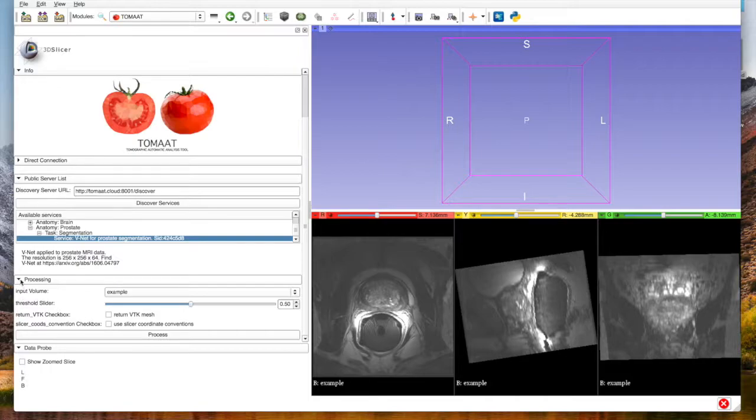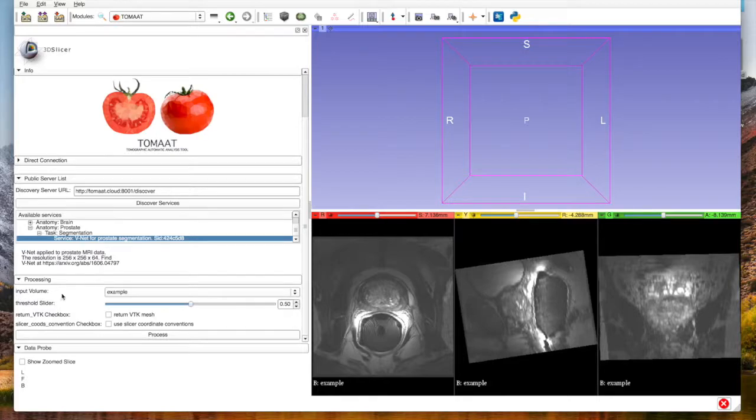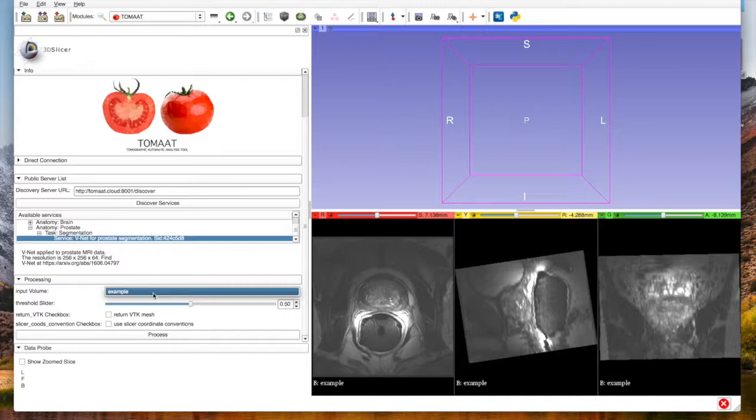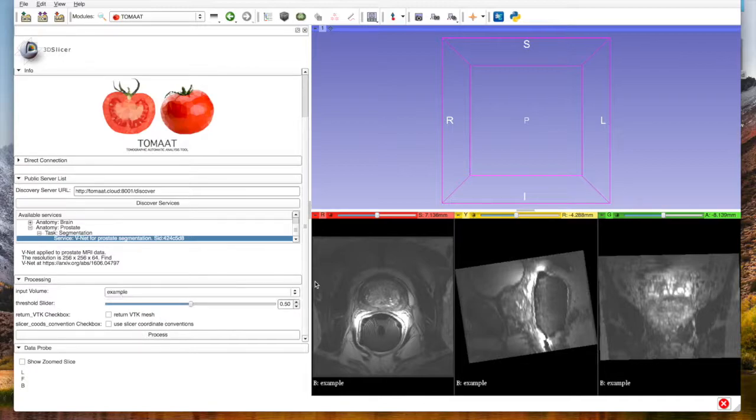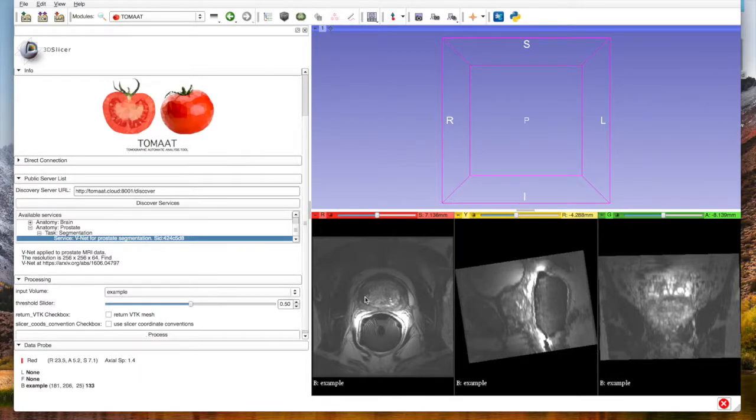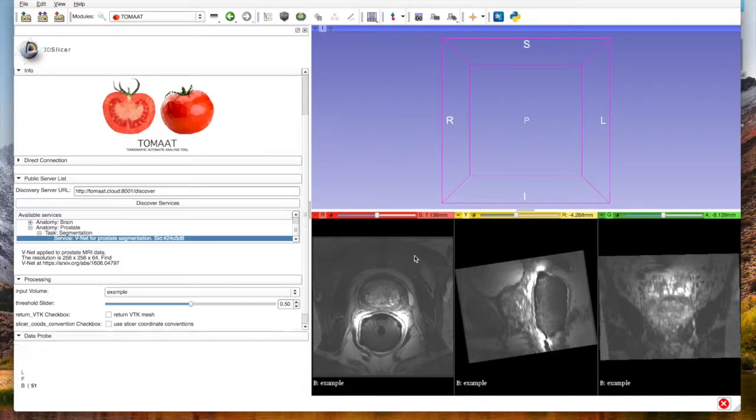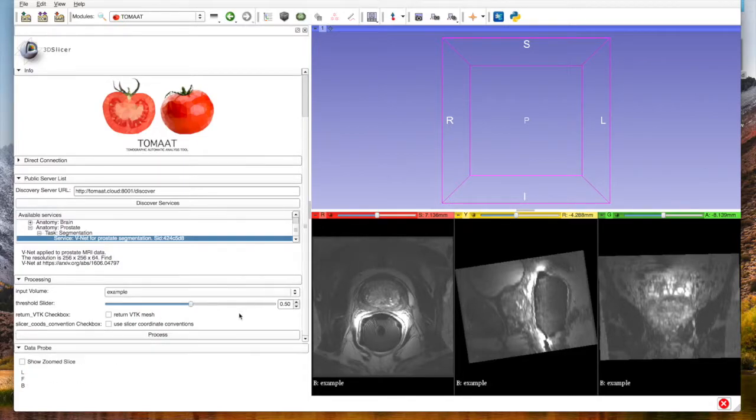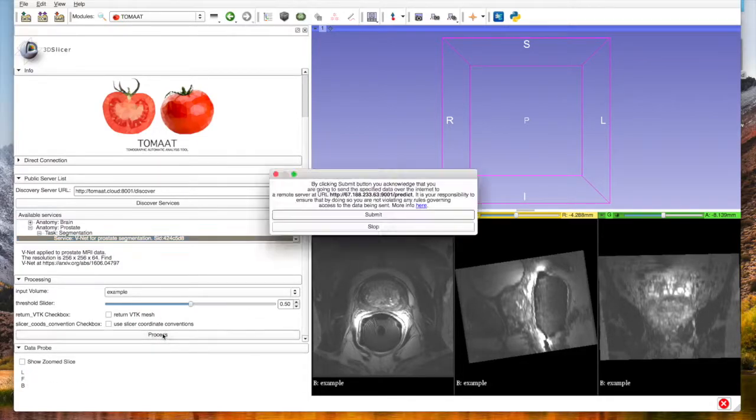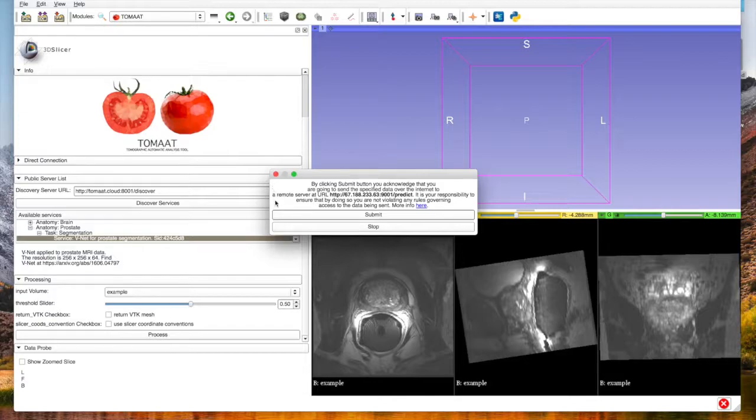We select example, which is our only volume present in this Slicer scene, and we click process. After reading this and agreeing with it, we can choose to submit, and in this case the data will be uploaded to the remote server and our response will be obtained.